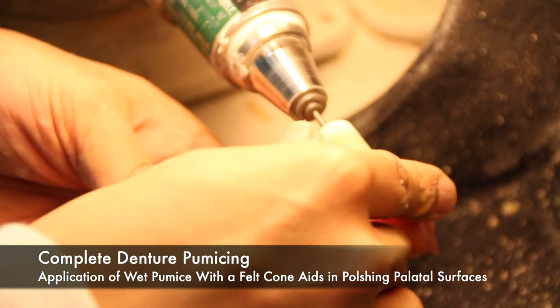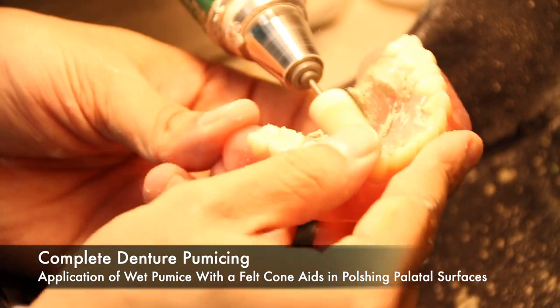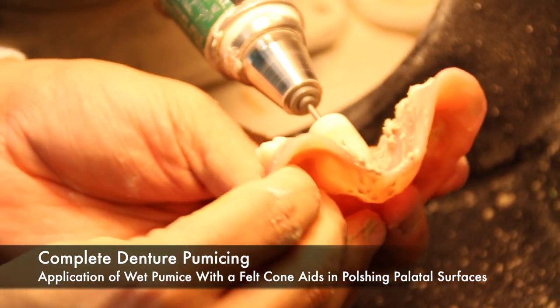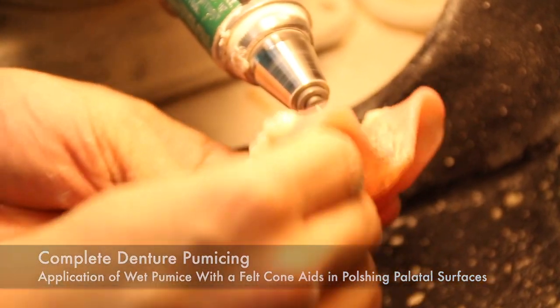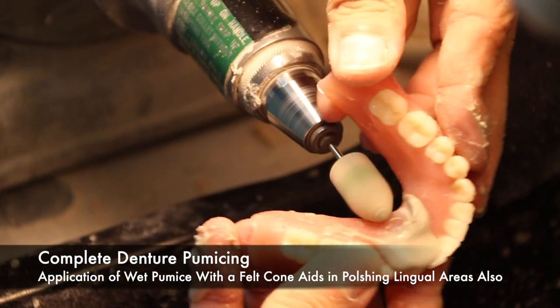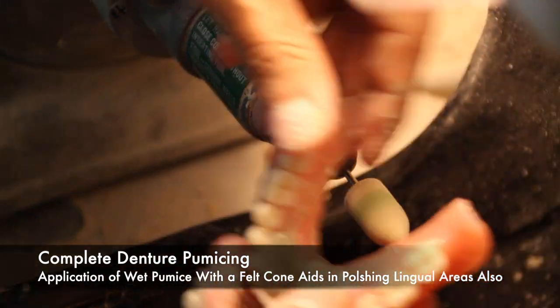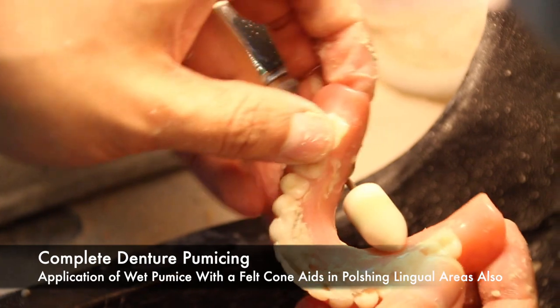In regards to hard-to-reach places, a felt cone tip can be used with pumice, and this usually aids in polishing palatal surfaces. Some patients have such a deep palatal vault that other tools might not be able to reach. A felt cone tip is great for these deep palatal areas and also on the lingual areas of mandibular dentures.